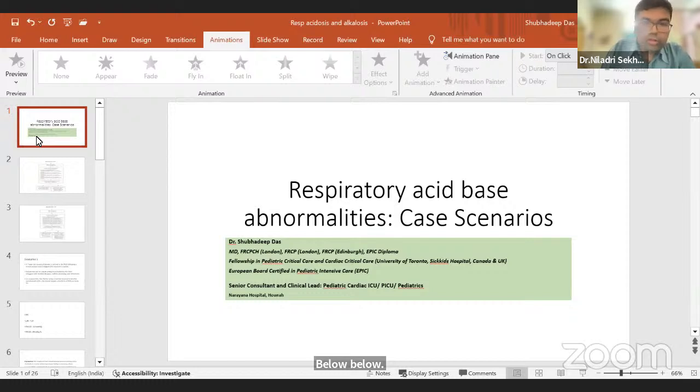Okay, yeah. This depends upon your center policy, but usually in small children it is better to go for a 1 cc syringe because they have very little blood volume, and if you keep taking 2 ml or more, they can develop iatrogenic anemia. But please remember, in a 1 ml syringe you can have only 0.05 ml of heparin, not more than that.